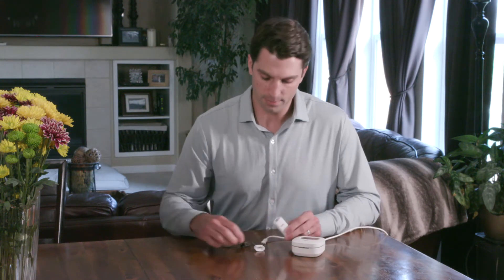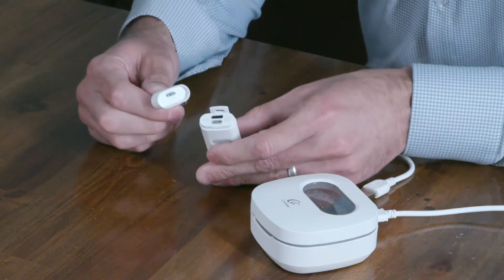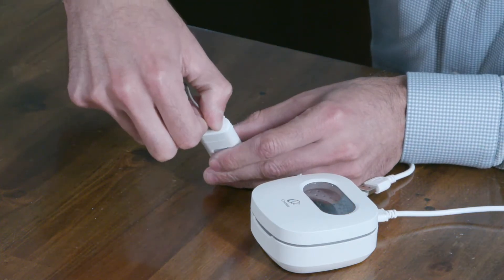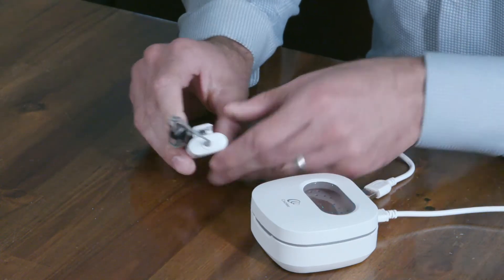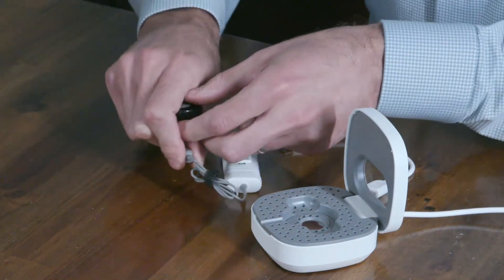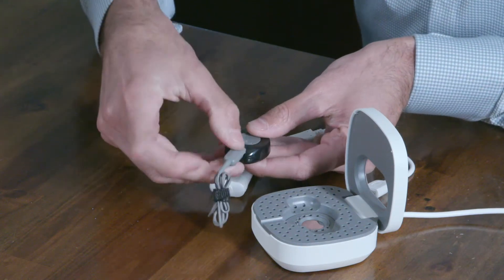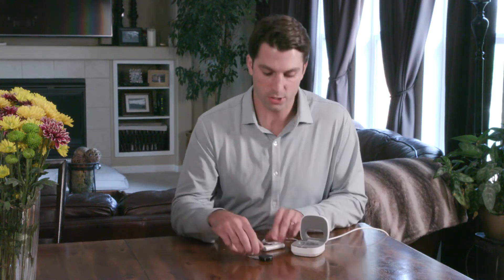To set this up, insert this plug here into the top of the portable charger, then plug the other end into the back of the Kanzo 2. You can clip this to your shirt and wear it while it's charging.